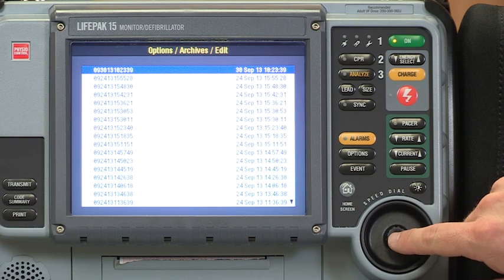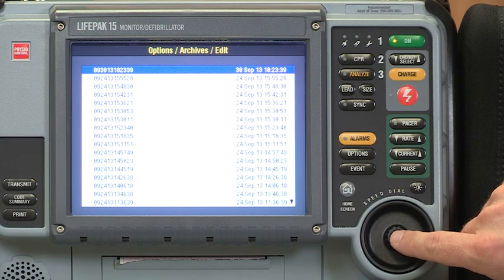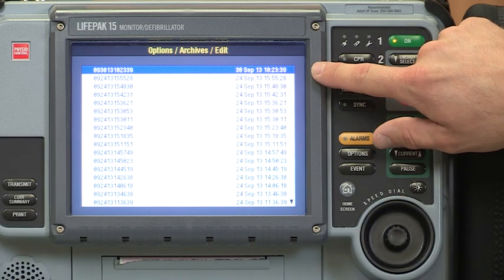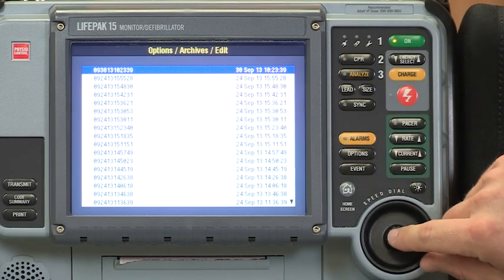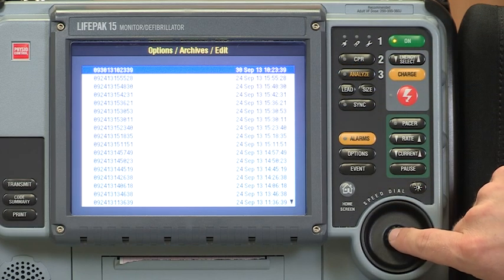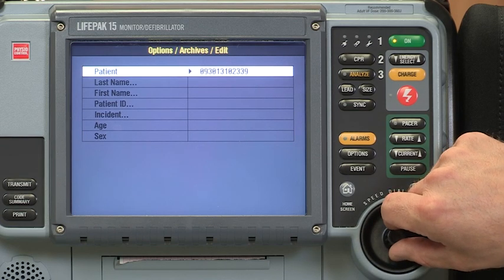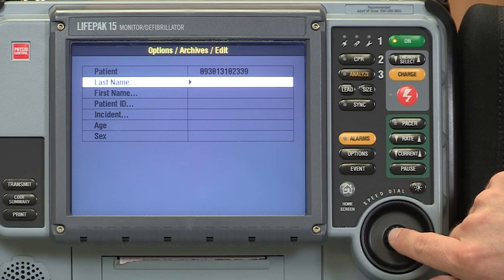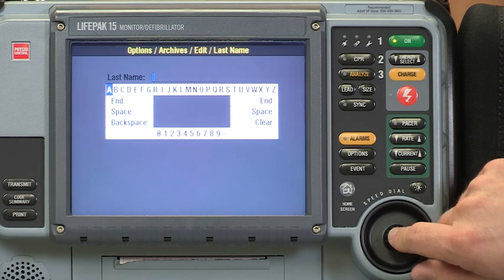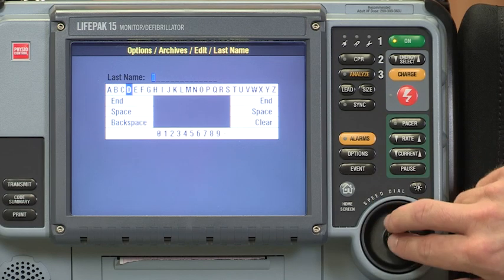In most instances, this will probably be your CPR event that you've gone on. So if that happens to be the event, and you can double check this over here based off of date and time, and you confirm that your patient, go ahead and select that patient. Once you've selected that patient, go to last name, enter the patient's last name. We'll use John Doe.